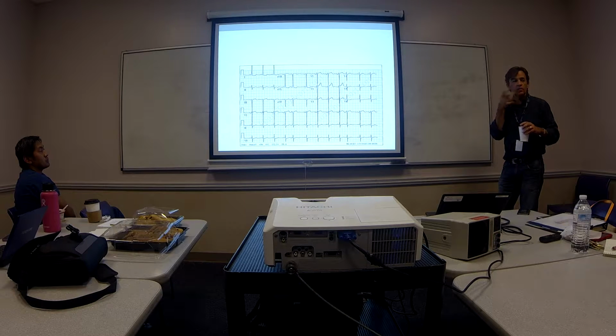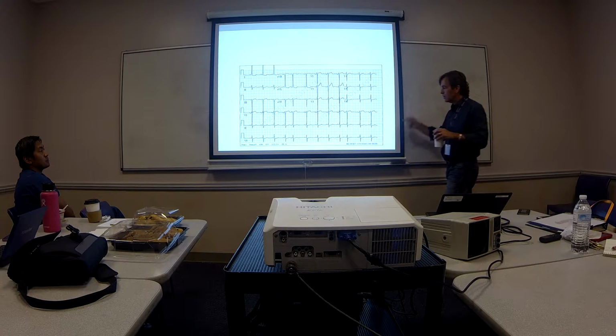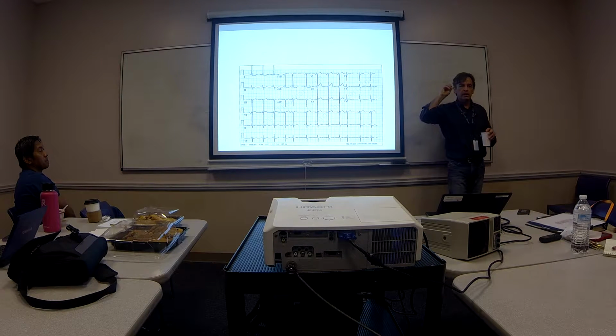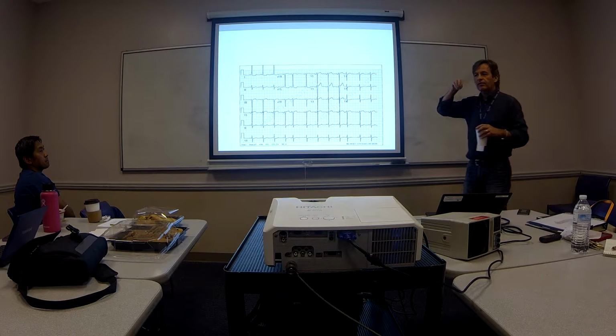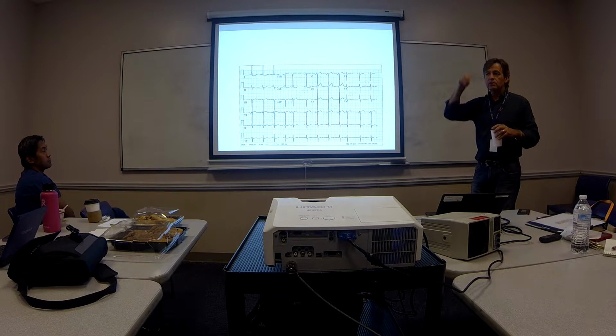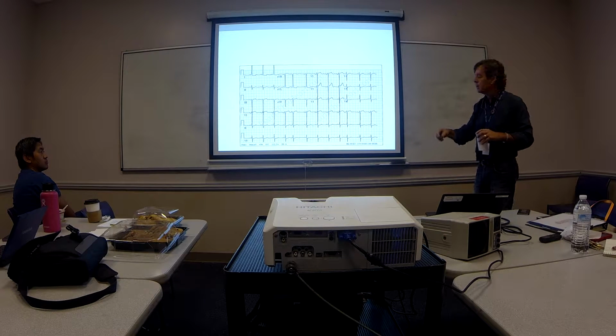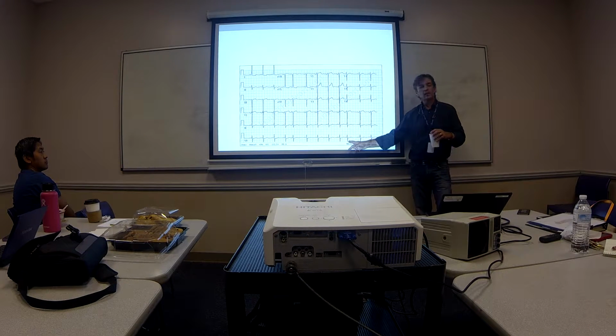How about here? Every now and then, early beat again, right? Darn it, it just happened. But what's the difference? The early beat looks the same as the regular beats. So that tells me the early beat takes the same path as the normal beat, which is down the AV node, down the ventricles during normal pattern. That tells me that these early beats are coming from the atrium. These are PACs.